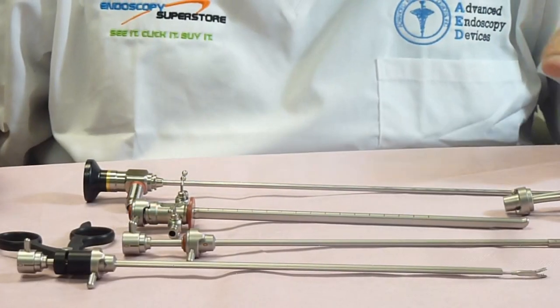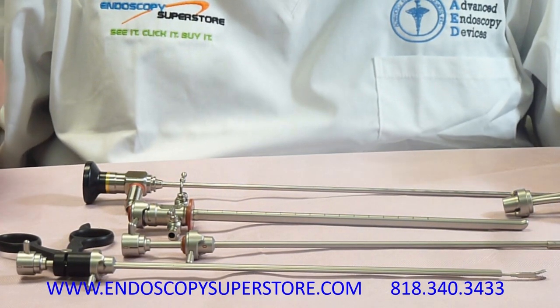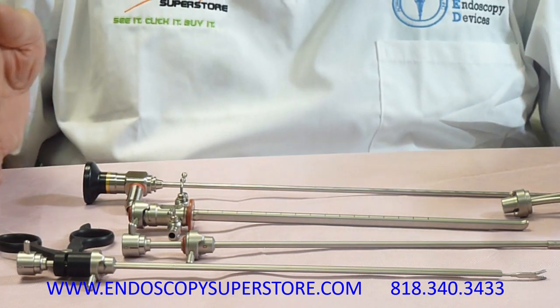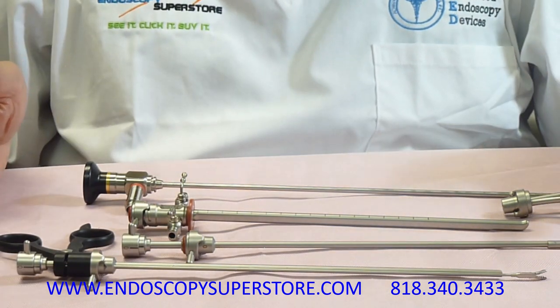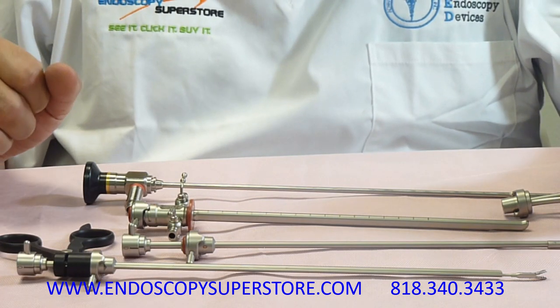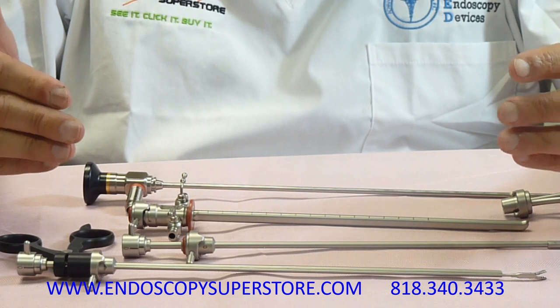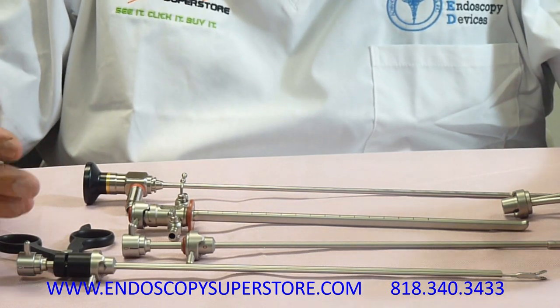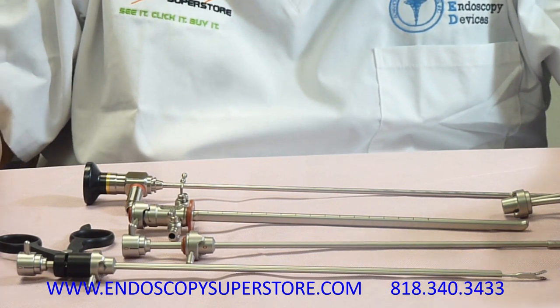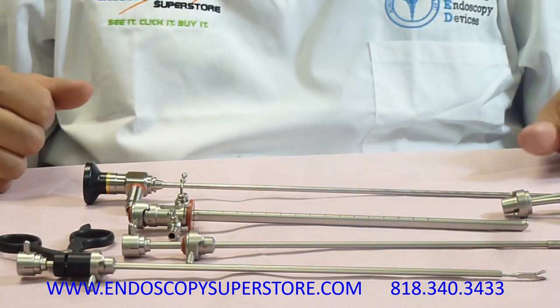All items demonstrated in this video are available at the Endoscopy Superstore on our online store. All items are in stock and are manufactured in Germany. These are all FDA approved in the US. We are based in Los Angeles, California, and we can take your orders and offer these products to you direct. Our site has all items listed with prices, specifications, and images so you're able to view the items. If you have any questions, call us — we'll be more than happy to help answer your questions. Thank you.